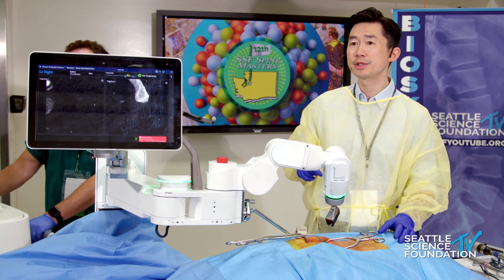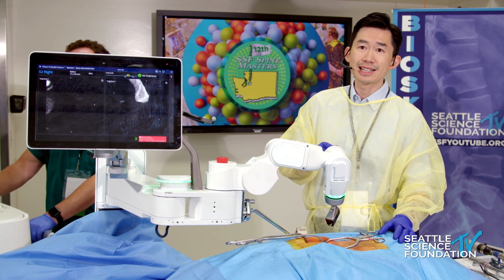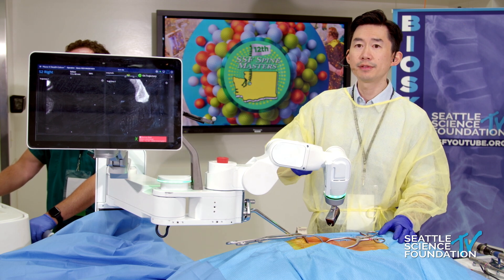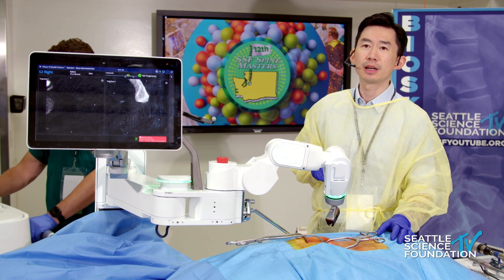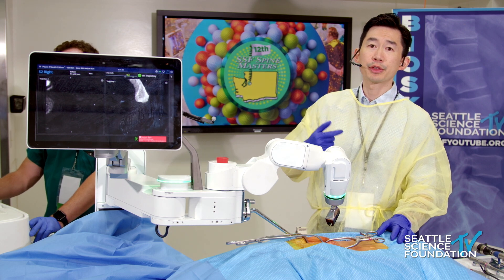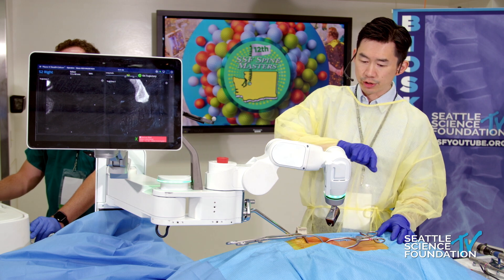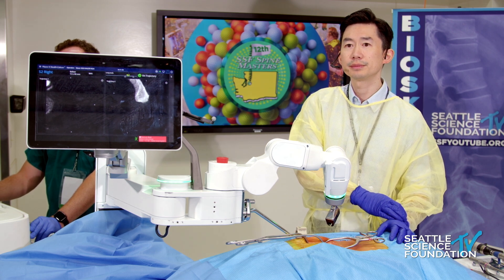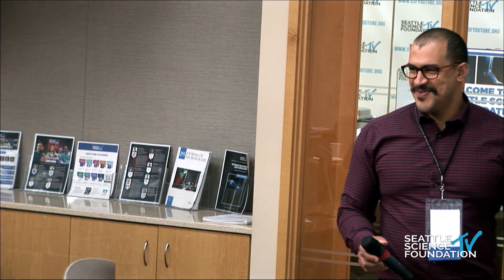Typically my diameters for S2 AIs, even if multiple, are at least 9-5s. If I'm doing a single S2 AI screw it's usually a 10-5, but if I'm doing multiple they're generally 9-5s that I'm able to fit. For a third one — if I really need to place it or put in a kickstand rod — a traditional iliac trajectory ends up being about an 8-5 80 or so. Next year I want it in less than a minute, so you've got some work to do.